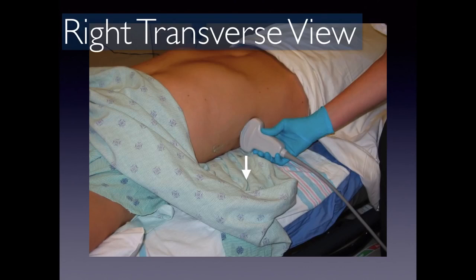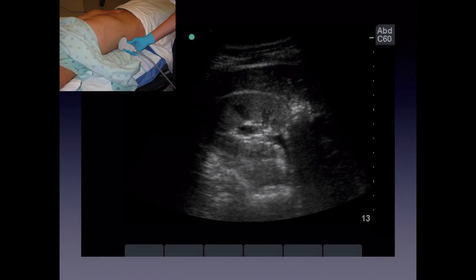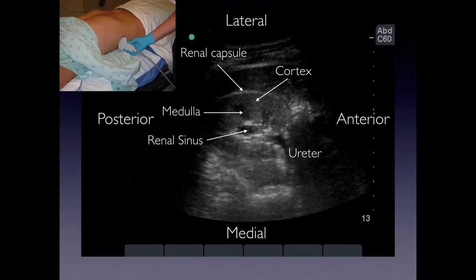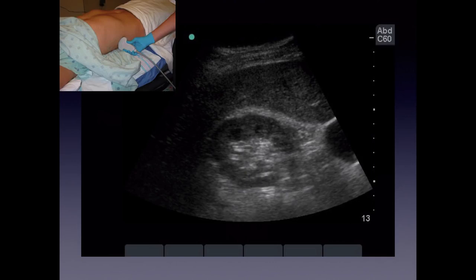For the right transverse view, the indicator is towards the bed. You get a transverse image of the kidney where you can sometimes see the ureter exiting and a medullary pyramid. We're still cutting the patient lateral to medial; the only change is flipping the transducer so the indicator is now posterior and the opposite is anterior. You can see the renal capsule and perinephric fat in this view as well.